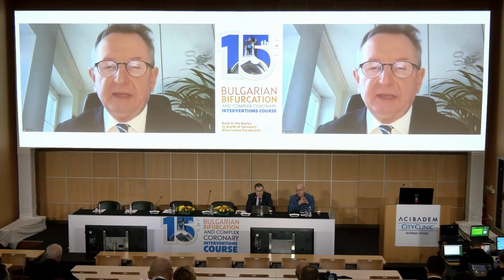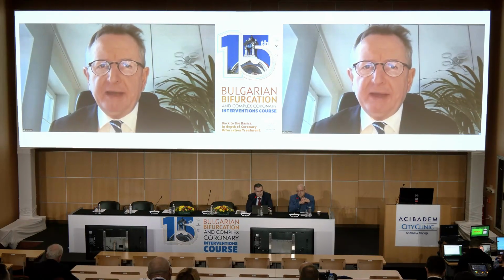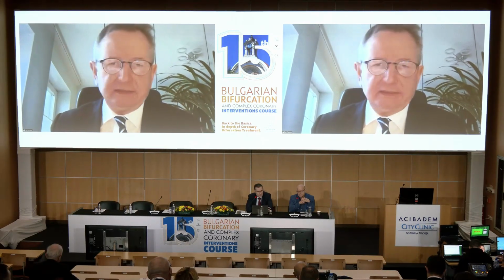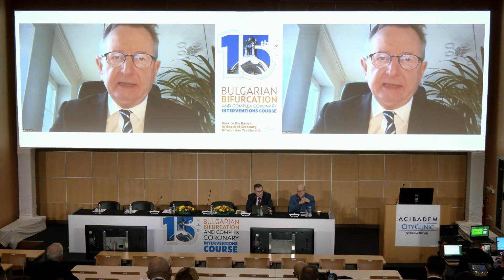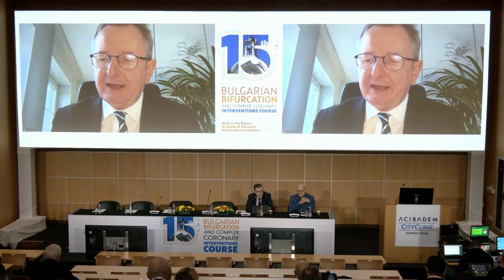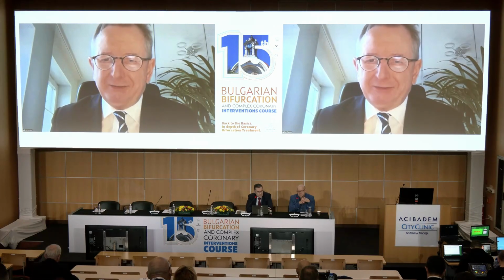I personally believe this. One week back we had a calcified meeting in Wrocław in Poland with live cases, and there was also a session with complications. What we saw, practically all burr entrapment cases which were demonstrated happened with the 1.25 burr. So that's why in our cath lab at the moment, this is really the only exception to use 1.25.